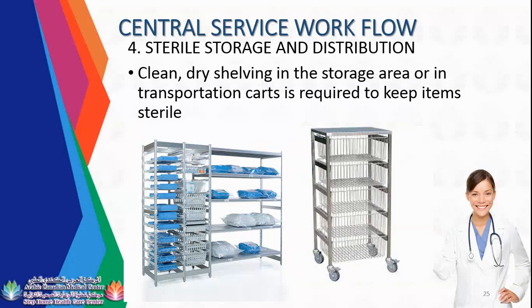Sterile storage and distribution is your last area in CSSD. Clean, dry shelving in the storage area or in the transportation cart is required to keep items sterile. As you can see, this is your dry shelving. In hospitals, they are using this one. In medical centers, they are just using cabinets or drawers.